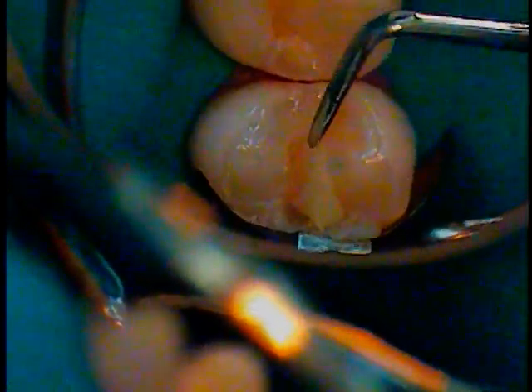So now I got to go in there and just come up with a Hollenbeck again. We'll do the buccal wall first. And literally just condense it in the shape of a V. I'm building up that wall first.